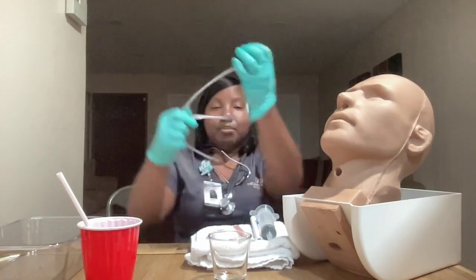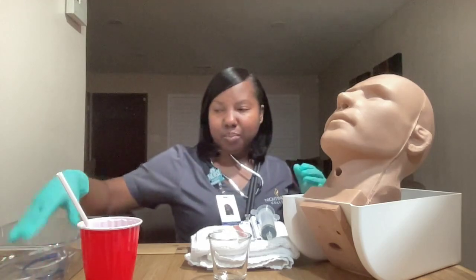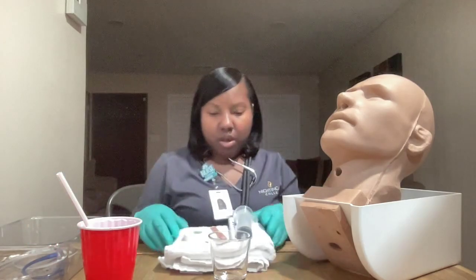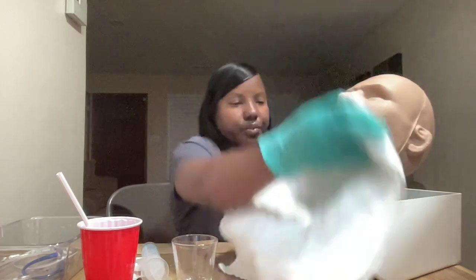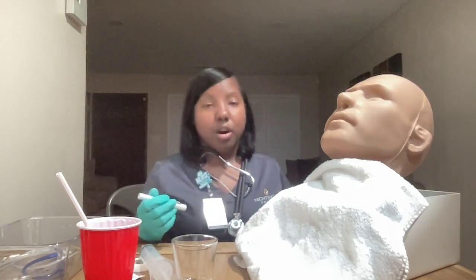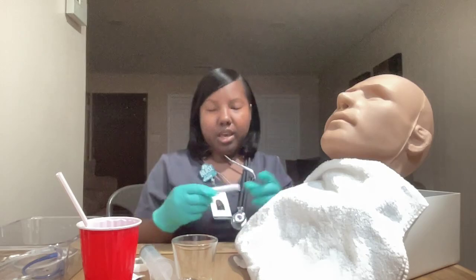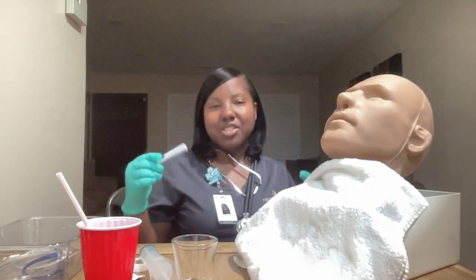Now I am going to place the tube in my basin of warm water. Warm water warms it up a little to make it more comfortable and also makes it more pliable. I'm going to place this towel around the patient. I will raise the bed to a good working level and ensure that my patient is in the Fowler's position — that placement was done prior to measuring.